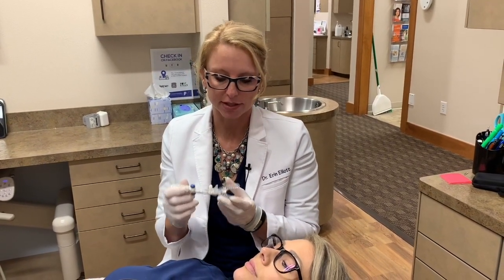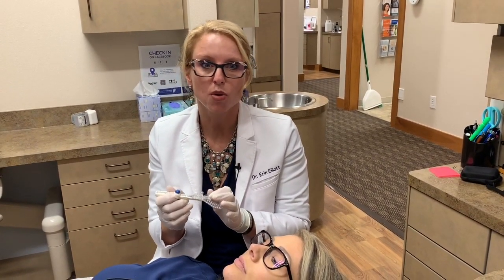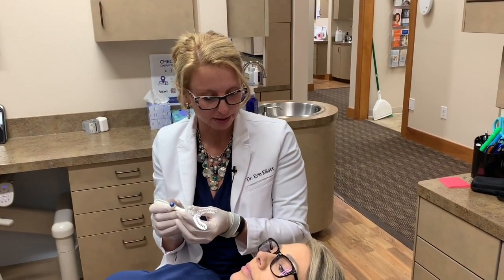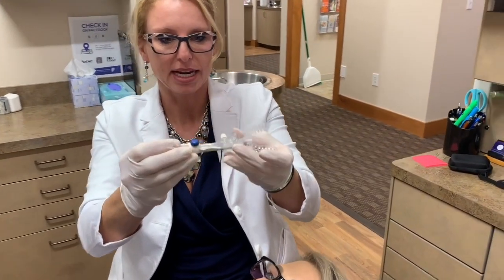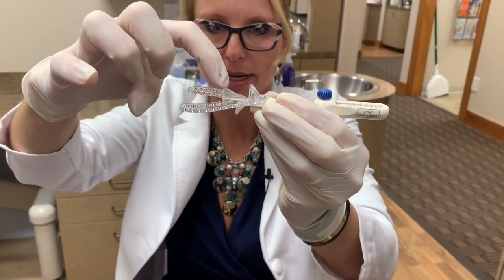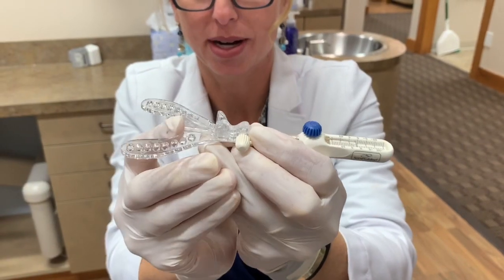The big advantage of the SOMGAGE is that we can also vary the vertical. Some people do need more vertical height — more room for the tongue. Most of the time I try to minimize vertical, but for the sake of showing you, we're going to play with that.